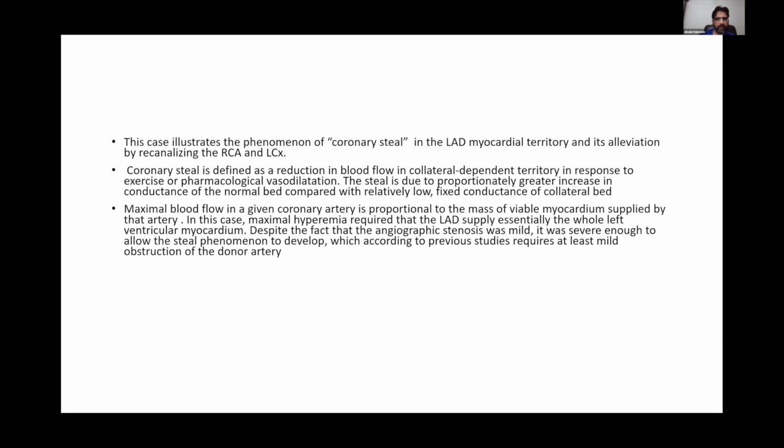There's a lot of work that is done in this area, but I thought this was helpful because going in, one would misconstrue this as ischemia of the LAD. The patient would, in many instances, be sent for bypass surgery. And if the LAD truly is not ischemic, after bypass, the LIMA may actually never mature.